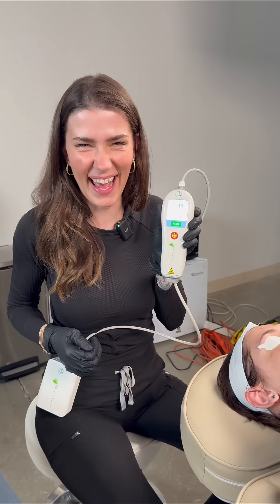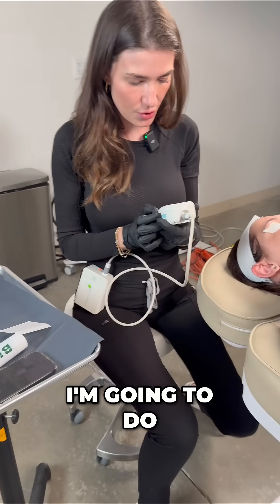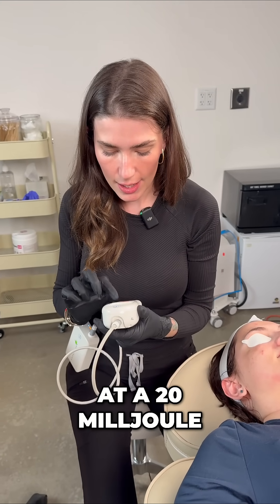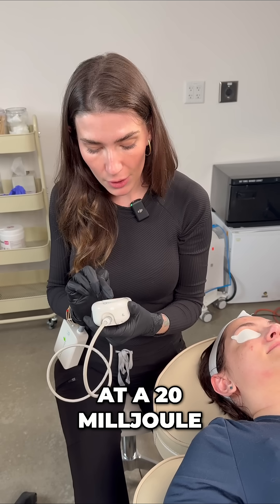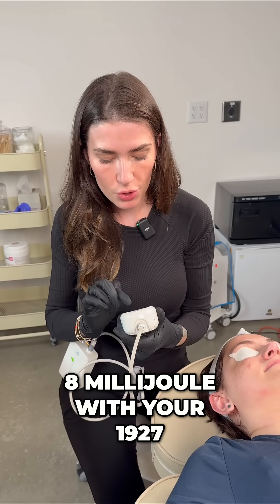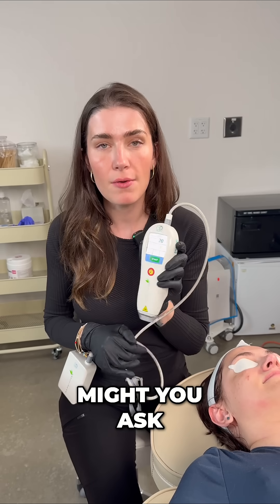Good job. What density are you going to do? I'm going to do a 1.5. So let's do — I'm going to start at 20 millijoules for your 1550, and then I'm going to go to 8 millijoules with your 1927. Why might you ask I'm doing this?